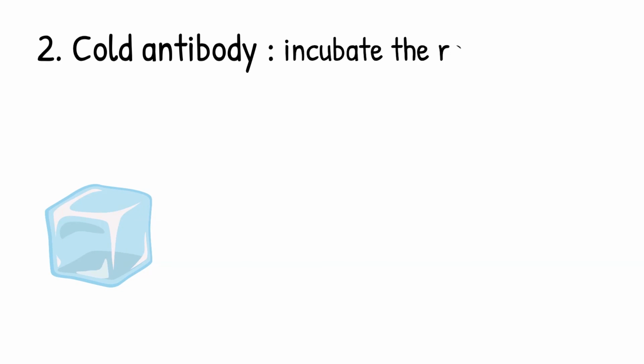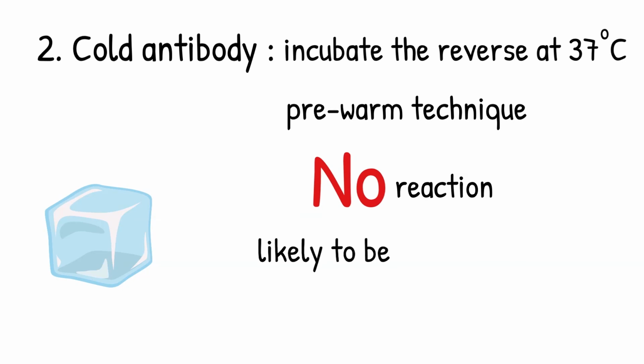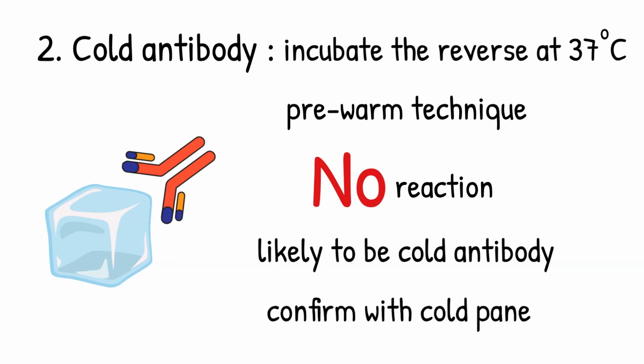For cold antibody, you can test this suspicion by incubating the reverse at 37 degrees Celsius or performing the test using a pre-warm technique. If the reaction disappears, then you are more likely to have a cold antibody, which can be confirmed by performing a cold panel.